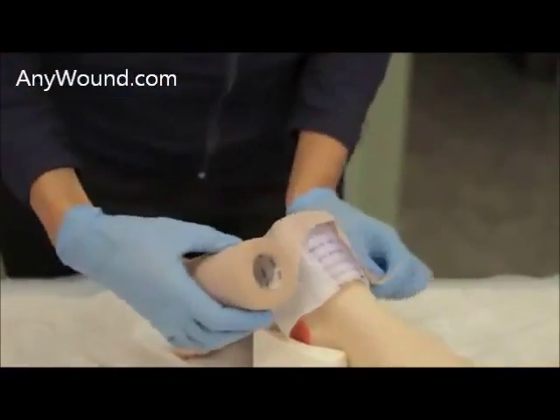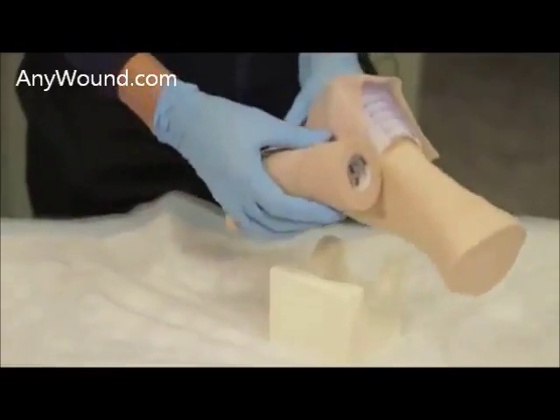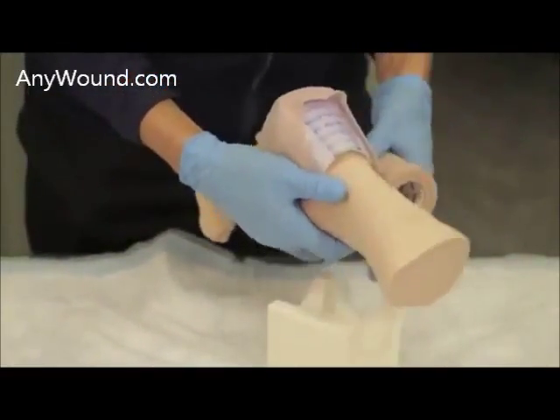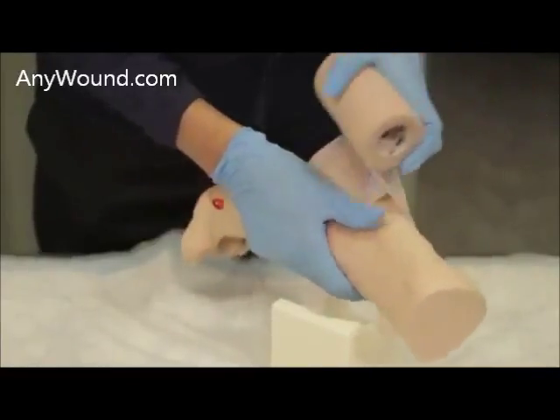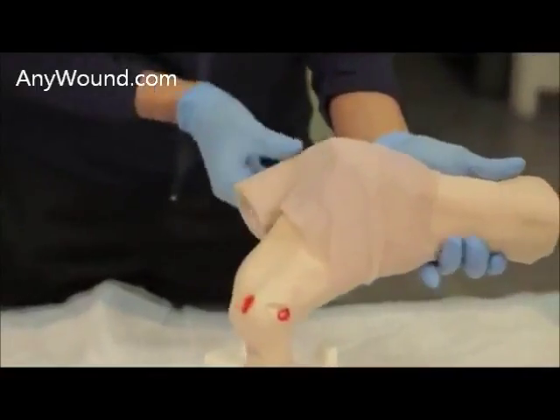we will further secure this because this patient will be a walking patient. The Coban allows them to ensure full contact with the wound. This is Coban.